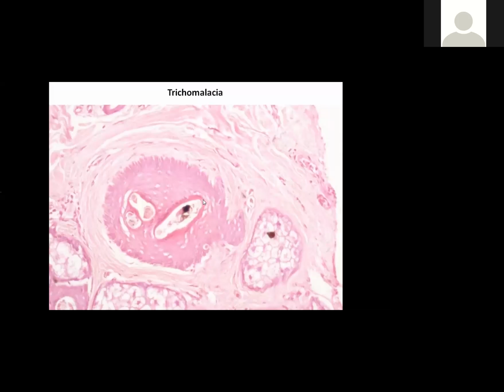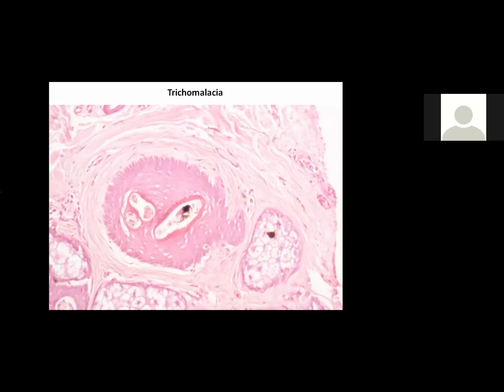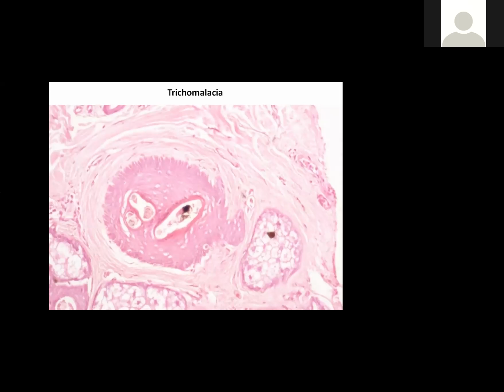And in addition, if we look at the hair shafts in alopecia areata, they are highly distorted and again show pigment deposit, which we refer to as trichomalacia. So if we see all features of androgenetic alopecia, which means miniaturization of hair follicles and an increased number of hair follicles in the non-anagen stage, but with additional findings of trichomalacia and pigment casts, even in the absence of the characteristic feature of peribulbar inflammation, we can still make a diagnosis of alopecia areata.